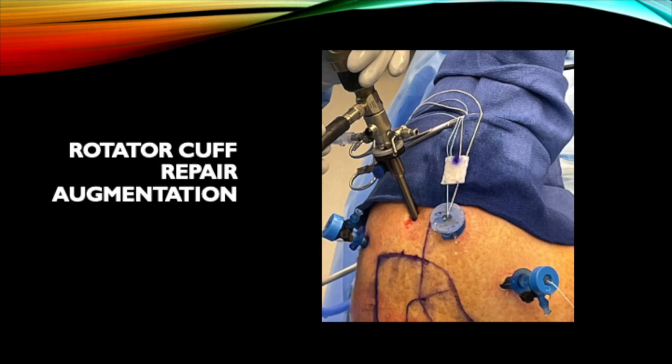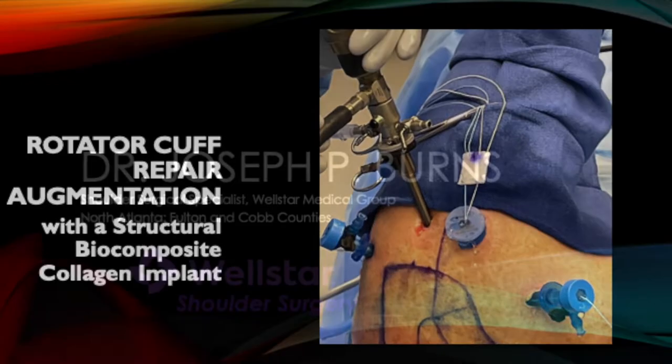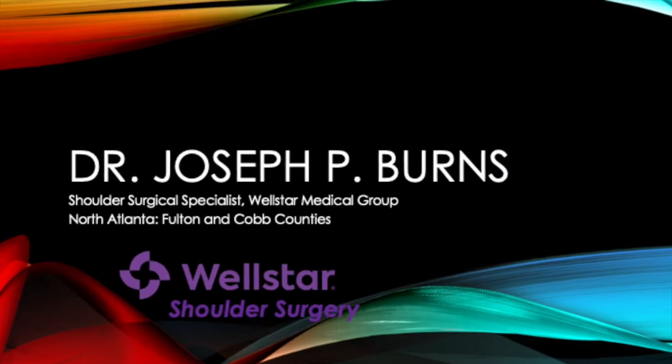This video will demonstrate rotator cuff repair augmentation using a structural biocomposite collagen implant. I'm Dr. Joe Burns from the Wellstar Medical Group.